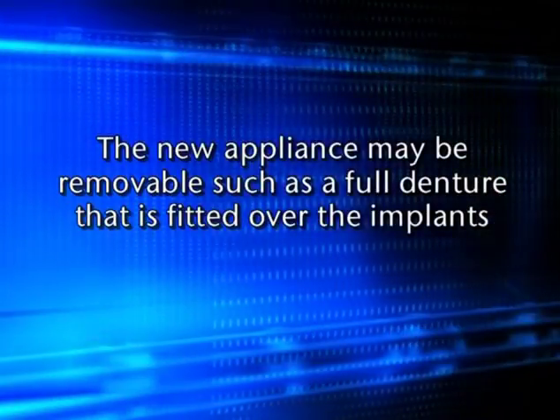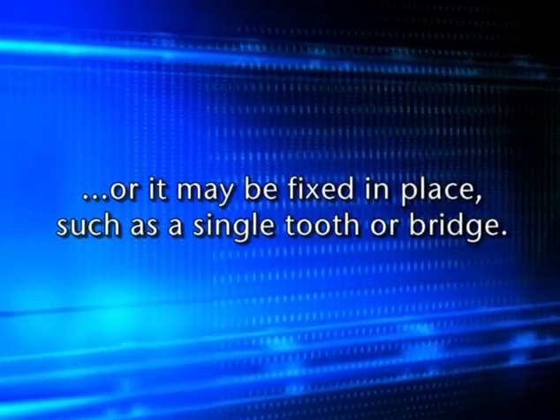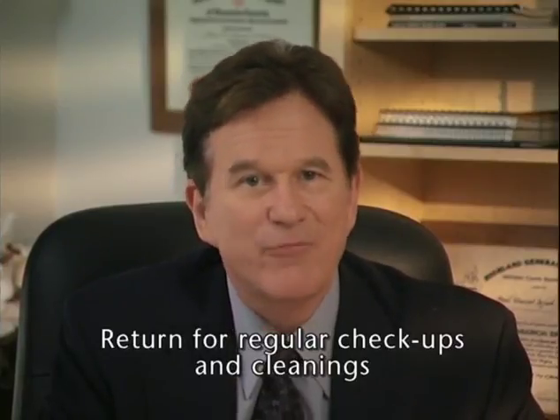The new appliance may be removable, such as a full denture that is fitted over the implants, or it can be fixed in place, such as a single tooth or bridge. The decision to create a removable or fixed dental appliance is determined on a case-by-case basis, depending on factors such as the number of teeth to be replaced. Good oral hygiene is critical to the long-term success of dental implants. The patient must carefully follow the hygiene prescribed by the dental implant team. This includes regular brushing and flossing and returning for scheduled checkups and cleanings.